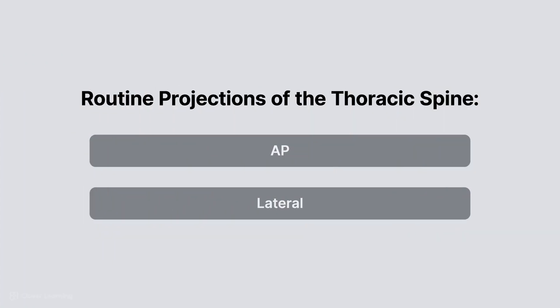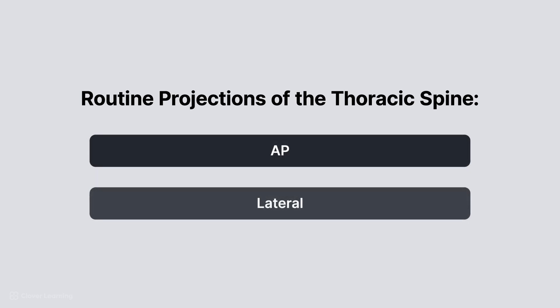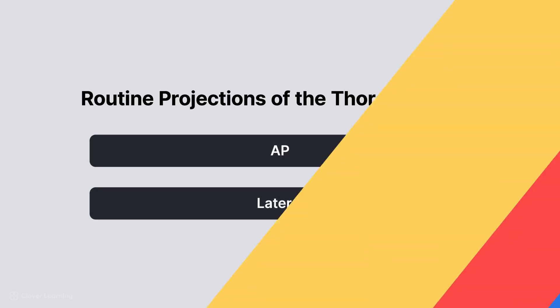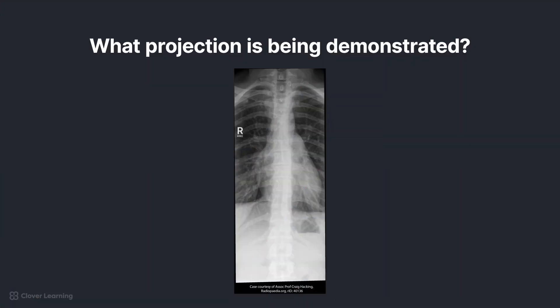As a reminder, the routine radiographic projections of the thoracic spine are AP and lateral. Take a look at this radiograph. What projection is being demonstrated? How do you know? Let's find out the answers to these questions.